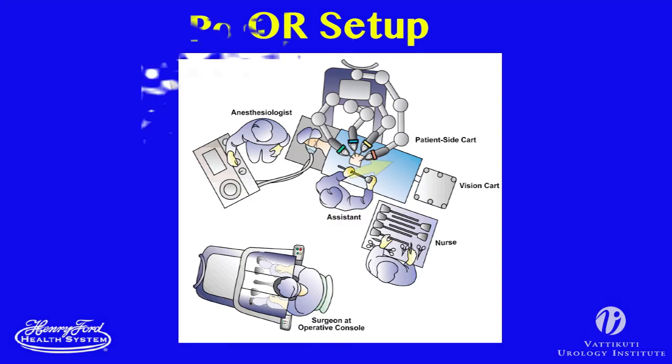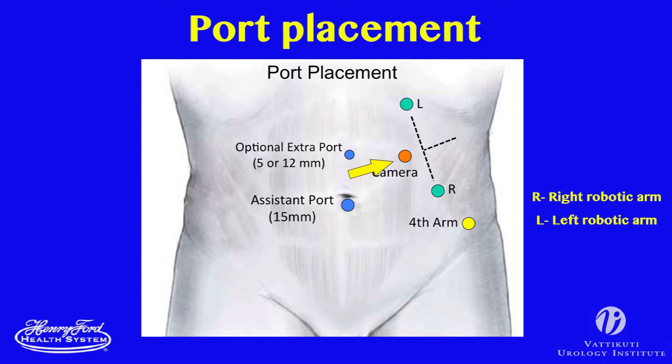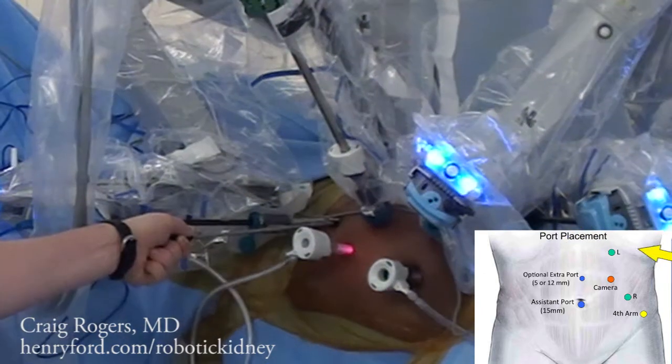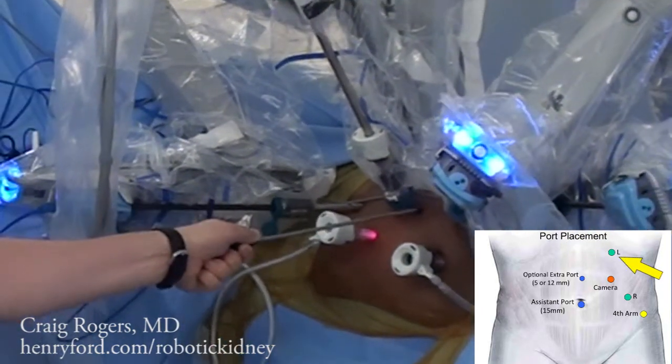The camera trocar is placed, the camera is placed through this port, and subsequent ports are then placed under direct vision. Robotic ports are placed laterally, and assistant ports are placed medially, as shown. We generally place the camera trocar lateral to the rectus muscle and cephalad to the umbilicus. Robotic ports are placed about 5 centimeters on each side of the camera port.